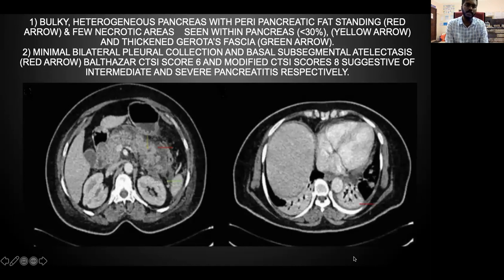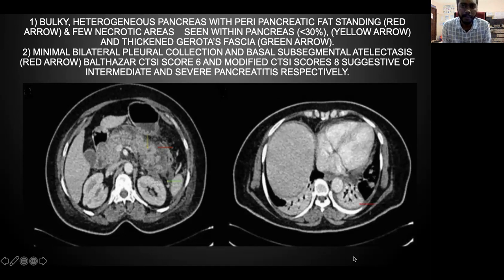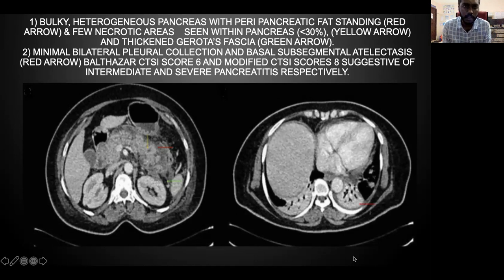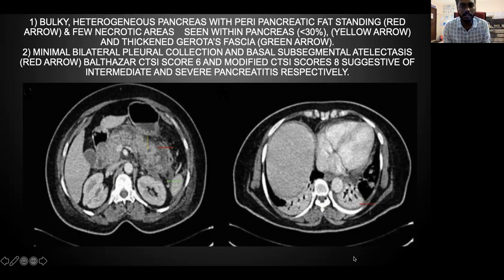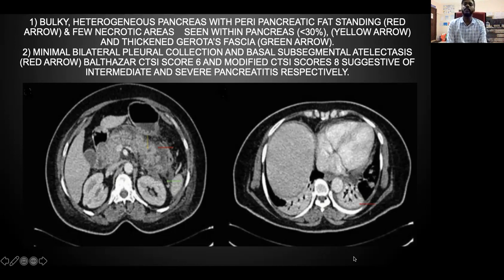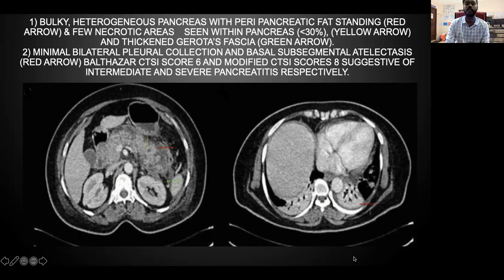The next image shows a bulky heterogeneous pancreas with peripancreatic fat stranding and necrosis areas involving less than 30% of the pancreas. Minimal bilateral pleural effusion and basal subsegmental atelectasis were seen in the second image. The Balthazar score was 6 and the modified CT severity score was 8, suggestive of moderate and severe pancreatitis respectively.